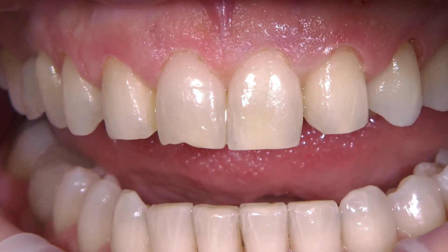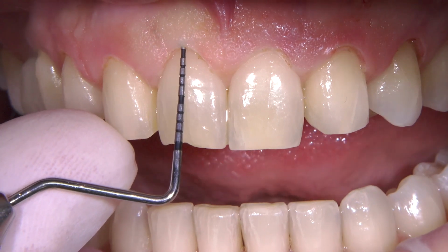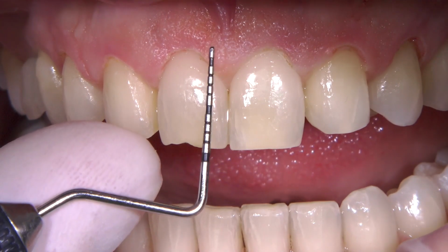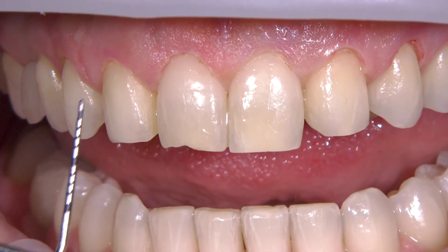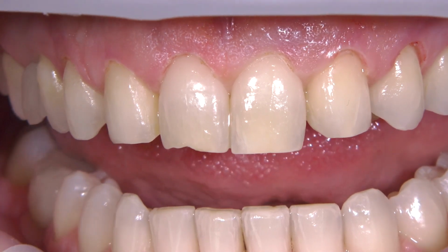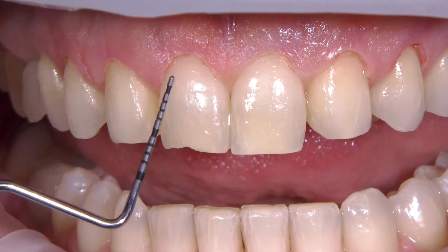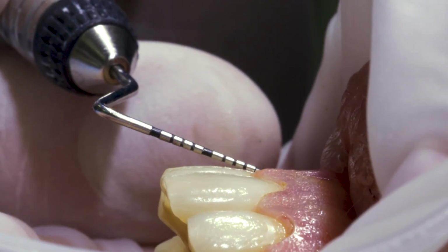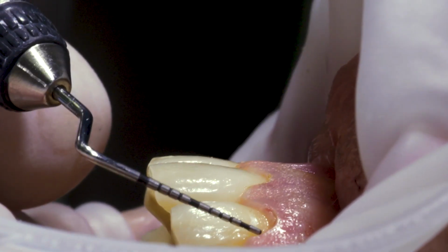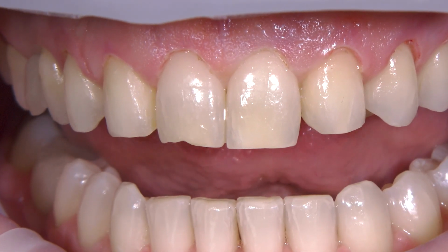Okay. Now, in the classic way, you would probe, and if the bone doesn't have the amount of space, which it doesn't here, in the classic way, you open a flap and you recontour the bone. However, what we have been doing a lot of times lately is we do this procedure in a flapless way with an ultrasonic tip, which I will show you in a little bit. You simply go in 3 millimeters. The length of the tip helps you because it is 3 millimeters, and you just recontour wherever you touch the tissue.